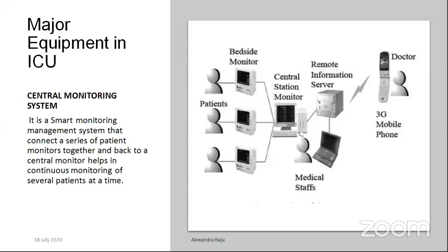The information server can also transfer the data directly to the doctor and to other medical staff in case of any emergency. This is the latest advancement that we see in use. This is the monitoring system. I hope you are clear with this. And we can go to the next slide.